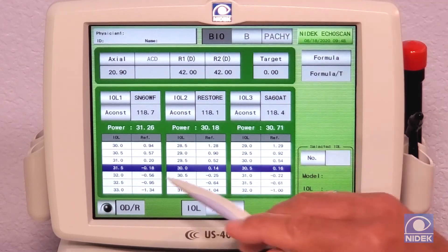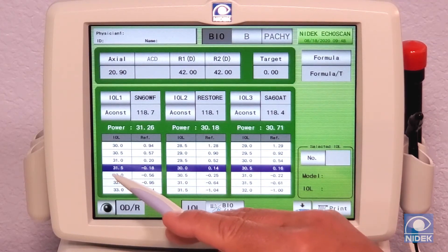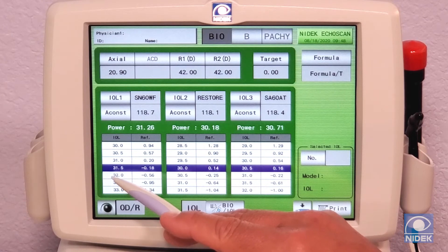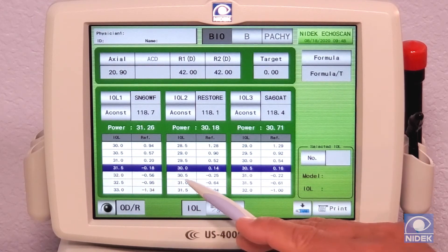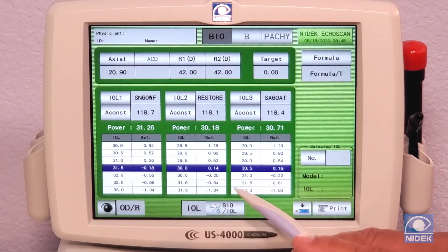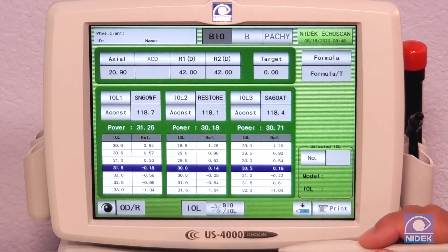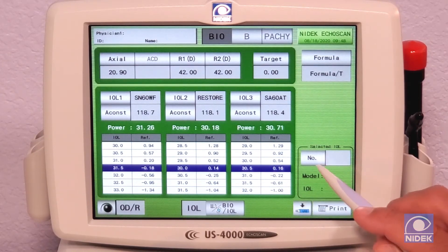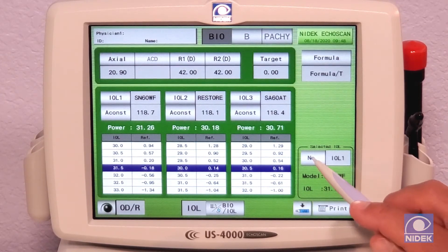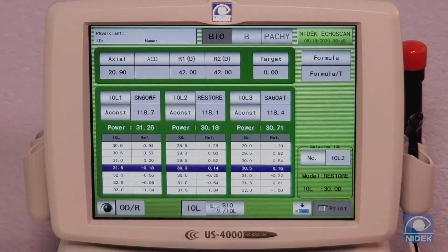All the IOLs can already be preset for the doctor's settings. As you can see, for each one of these IOLs, the US-4000 will select the proper IOL depending on all the measurements and your target refractive error. From here, we can select which IOL we would like and then print.